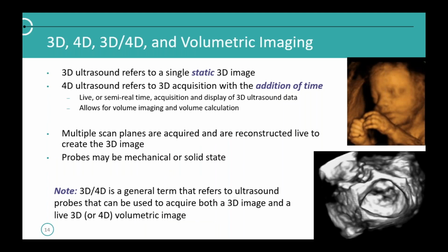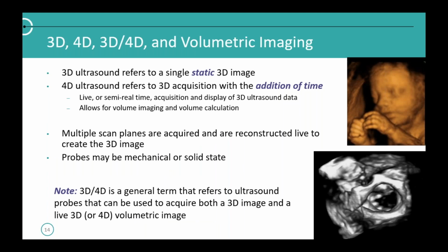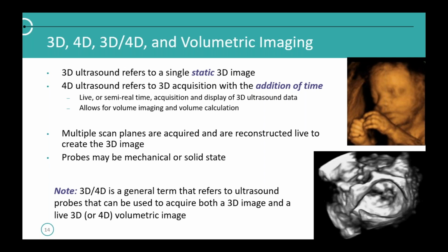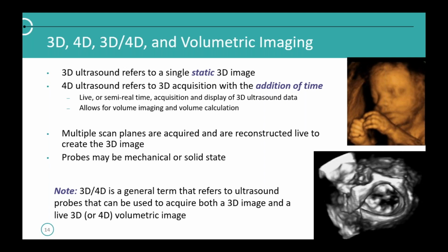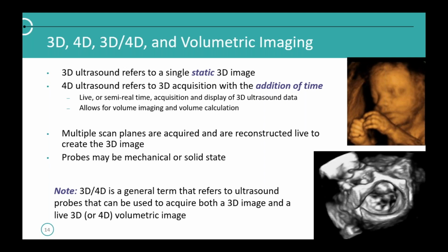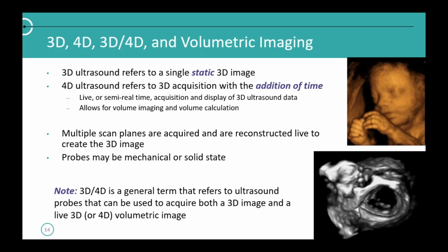Then we come into this stuff called 3D, 4D, and now 5D imaging. What's all that mean? So I'll spell it out for you here. 3D ultrasound is pretty much just a picture or a screen capture of a three-dimensional ultrasound. It's what we have on the image right over here. It's just a capture.